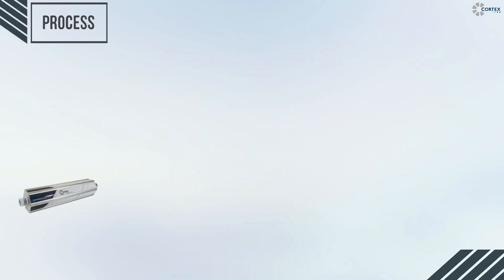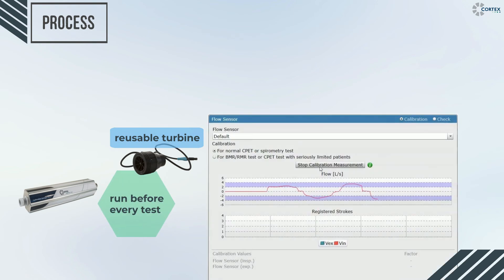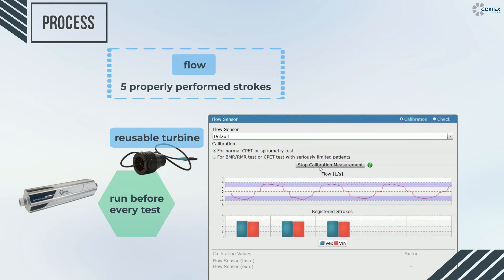Moreover, the calibration of the reusable turbine is mandatory to ensure accurate flow volume data. It is performed before every test and with the help of a three-liter calibration pump, five successful strokes need to be completed.